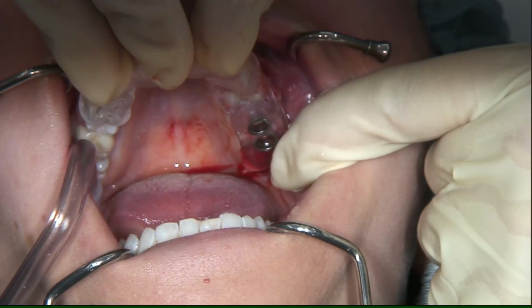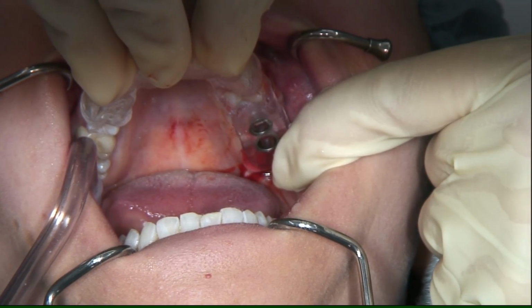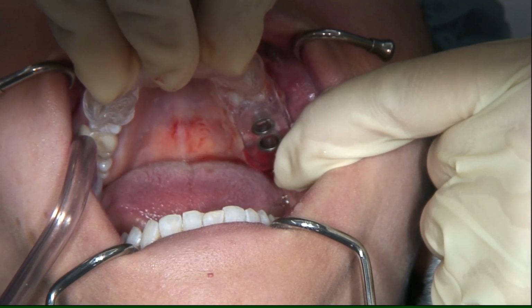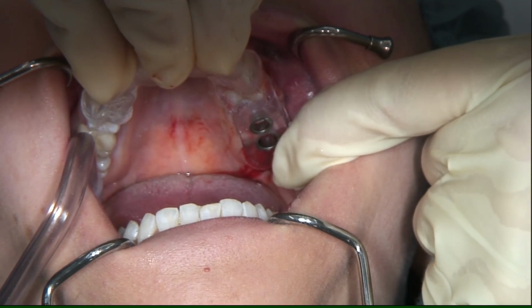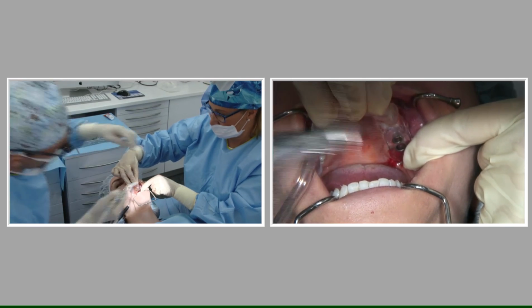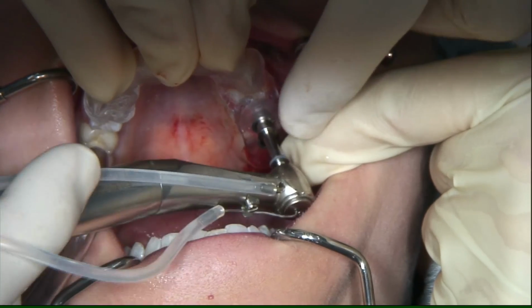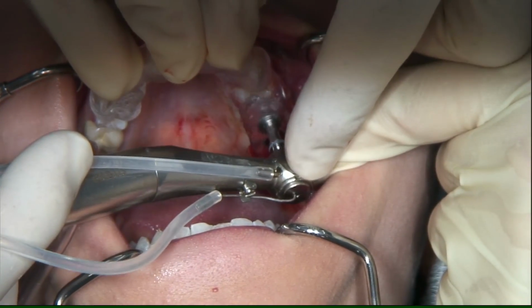You see now that was the expansion drill with 3 millimeter. So the twist drills, we call them Xive twist drills, are used in an ascending order until we reach the planned diameter of 3.8.